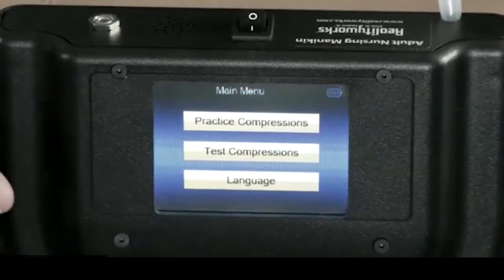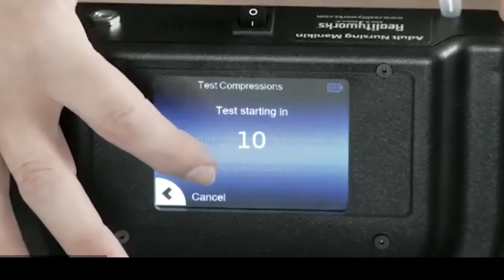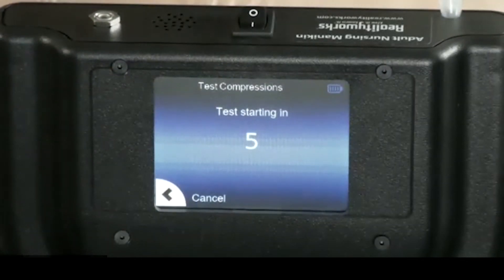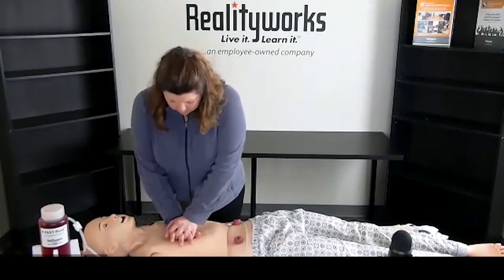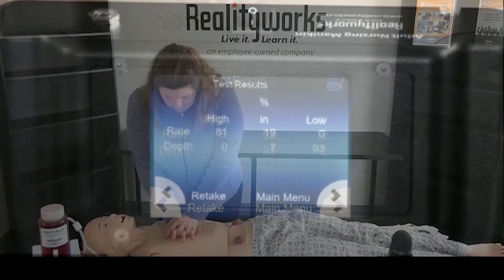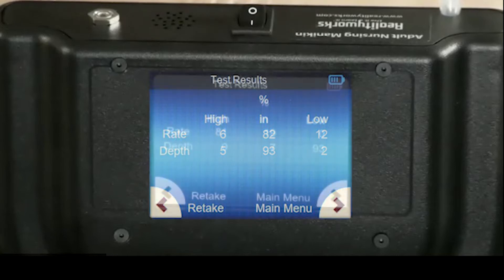Now let's take a look at the test compression mode. It'll count down. It's going to test me on the amount of compressions I do, the rate, and the depth for one minute. And then you can see your test results — the rate, the depth — and you can also retake your test.